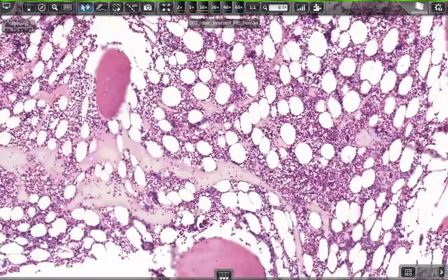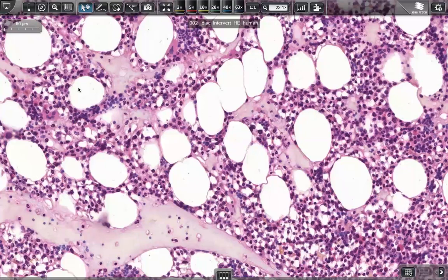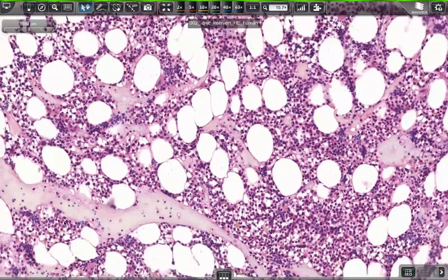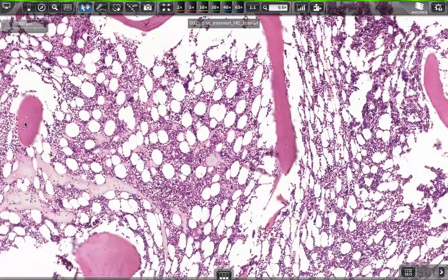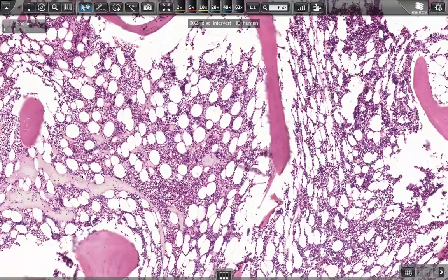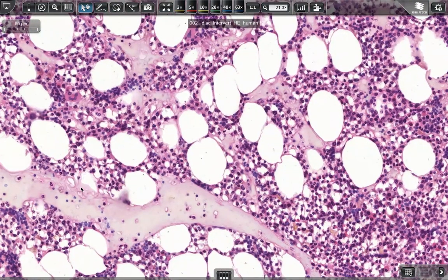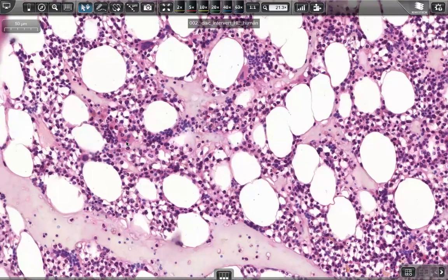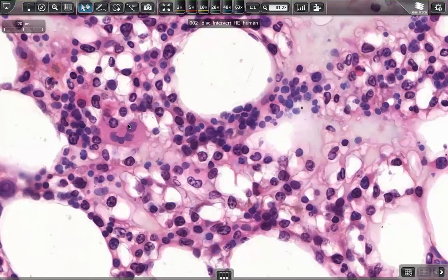Okay, so in the bone marrow, we have numerous elements of the erythropoiesis, red blood cells, everything, and we have bony structures as well. Oh, sorry, they are not. These are the eosinophil ones, and these pale ones are just the preserved plasma. And there are some multinucleated cells, this here. This is a megakaryocyte, which forms the platelets, the thrombocytes.